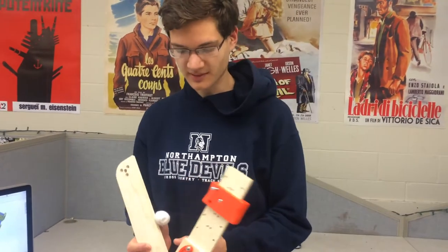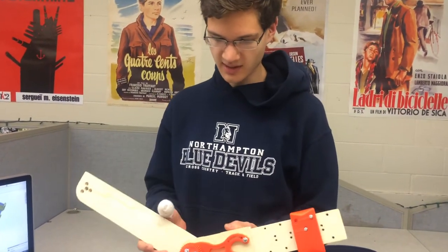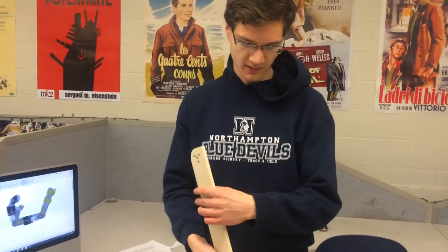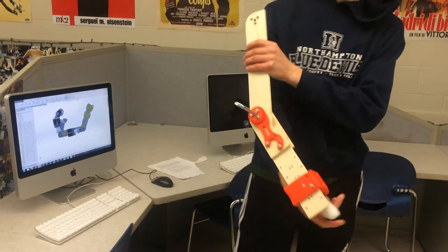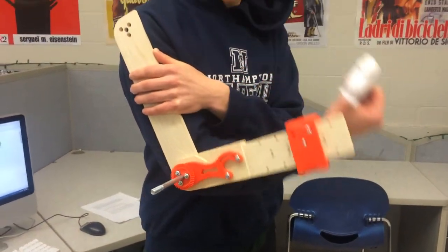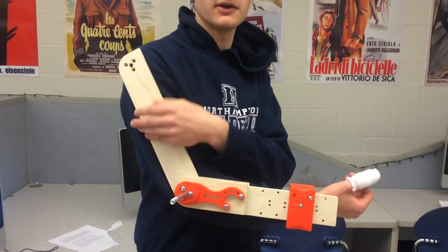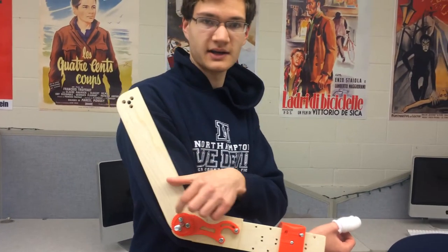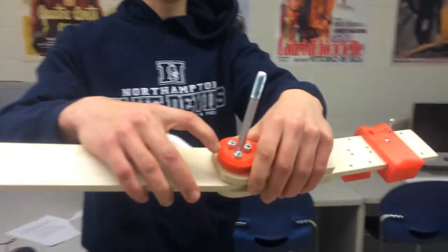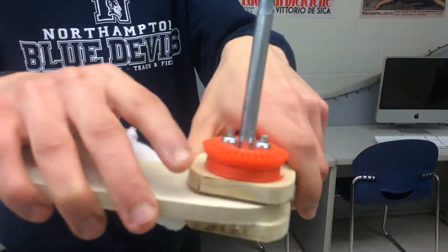My name is Tim, as Jeremy said. I created this robotic arm and it fits over your own arm. This is just a prototype made out of wood for now, but the basic idea is still there. Essentially how it works — a motor will power a gear right here and that will in turn spin this gear and that will move your arm.